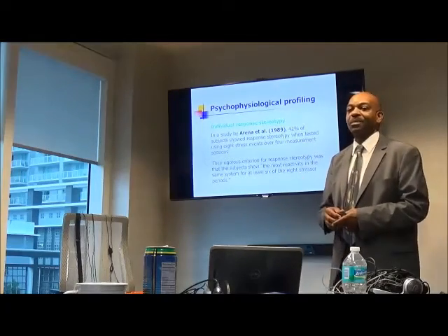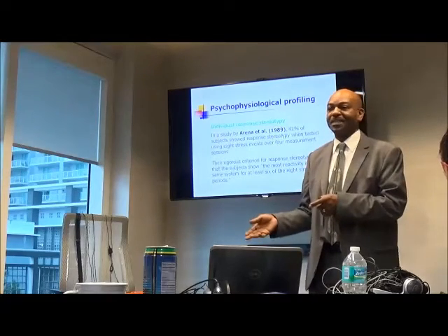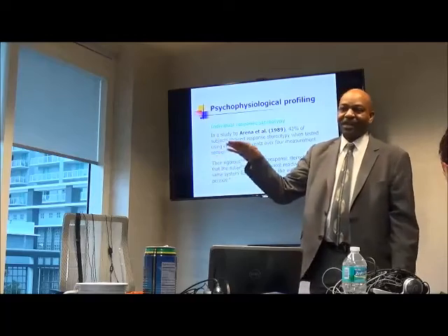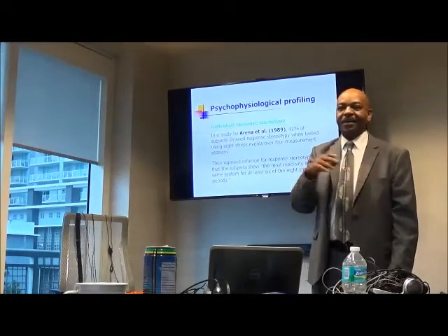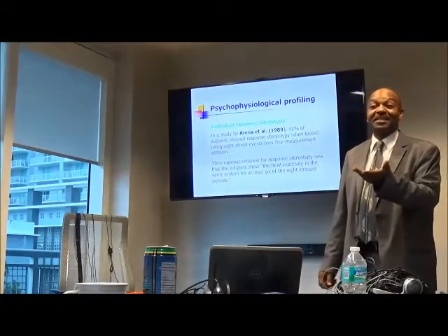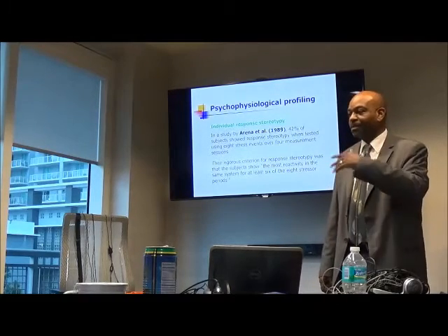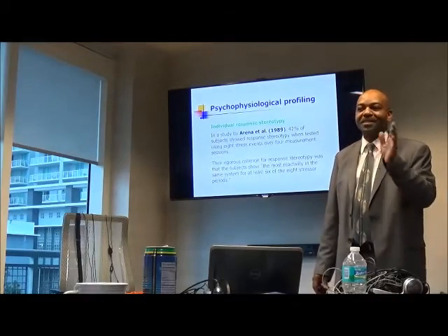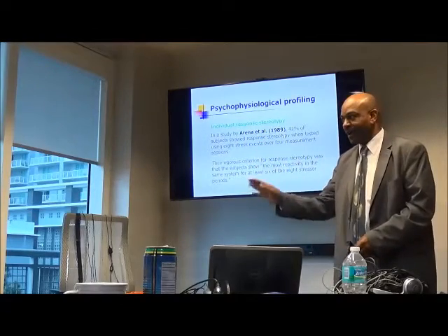I did a stress assessment with my father when he was alive, and I did a stress assessment with my mother. The same stressors and everything. His was like hardly any reaction, perfect recovery, and hers was all over the place. And it made sense to me because he was very easy dealing with problems, and she used to call him Mr. Cool because she would be saying, oh my gosh, this is terrible, and he was like, calm down.